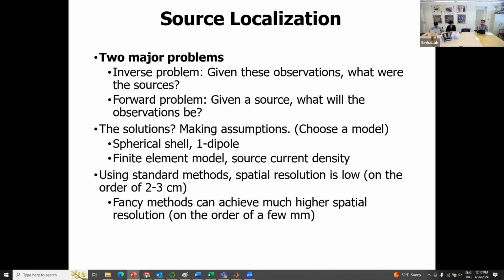I'm not going to provide all the information, because source localization, for example, can be taught in an hour class, with examples and so on. I've got also a lot of slides, but I'm going to probably skip them so that we have more room and time for practical examples with EEGLAB.